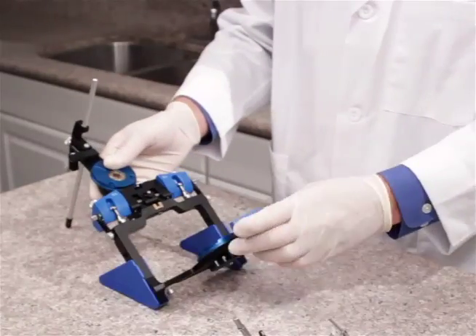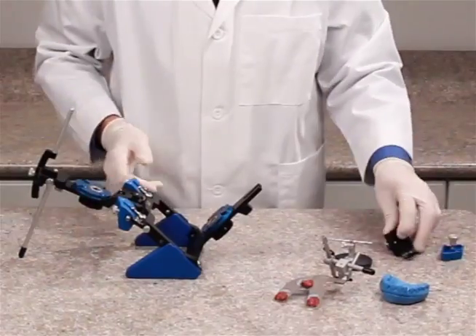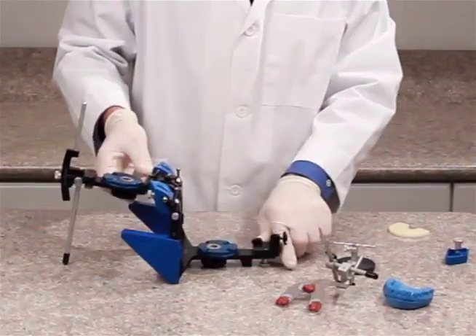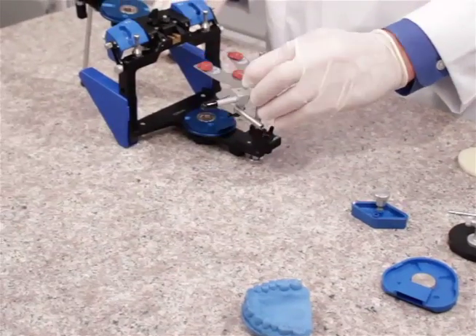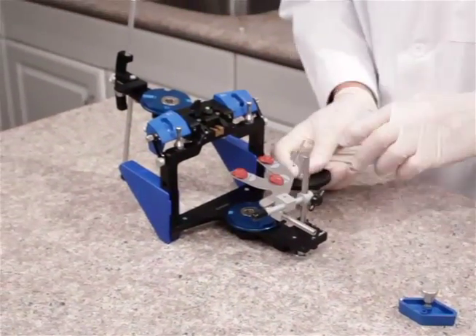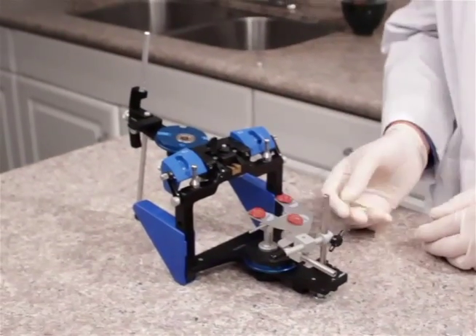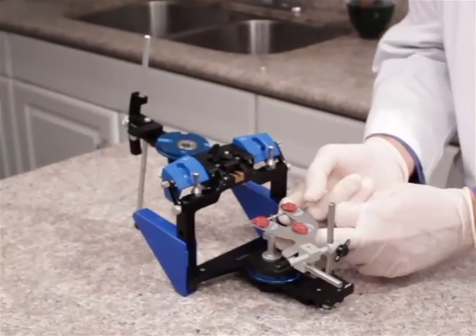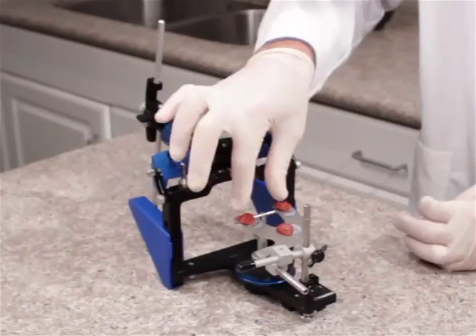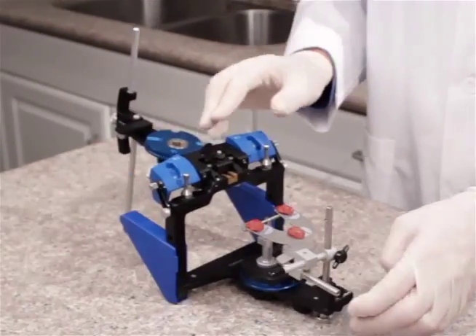Now we swing this back and we want to remove the incisal table and replace it with the mounting fixture, which slides into place and tightens with the screw. We can now add our bifork assembly to the mounting fixture and tighten it into place. We do have a bifork support system which we can index to the lower magnetic plate, and we can raise the teeter-totter up underneath the bifork and tighten it in place with the screw, creating a nice solid support for the cast during the mounting procedures.